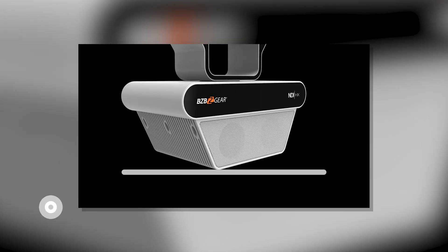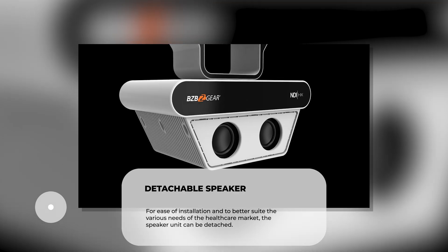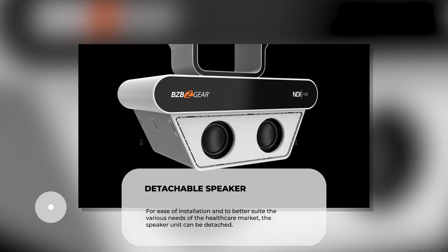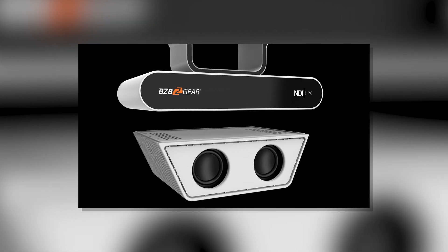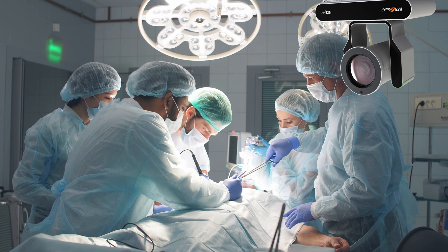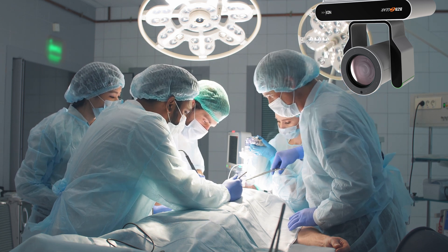The Nutrix comes with the ability to attach or detach a powerful speaker and microphone unit to facilitate telehealth needs, as well as other functions like surgery recording. On top of all this, the camera boasts unrivaled visual clarity.